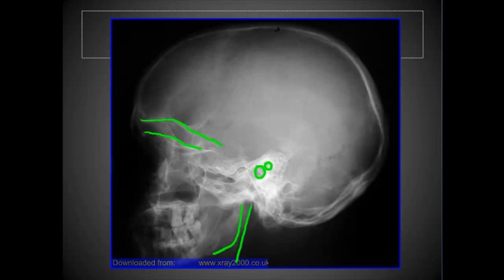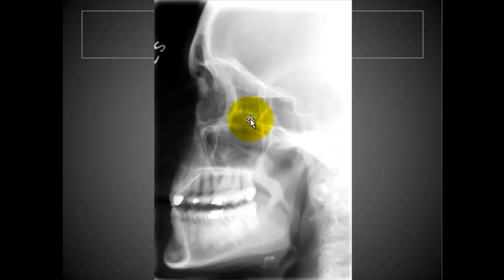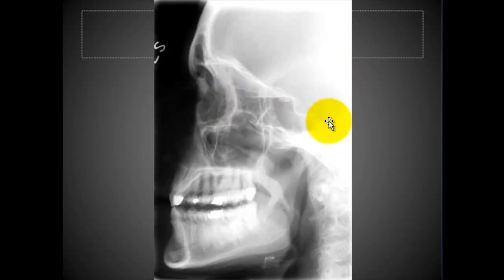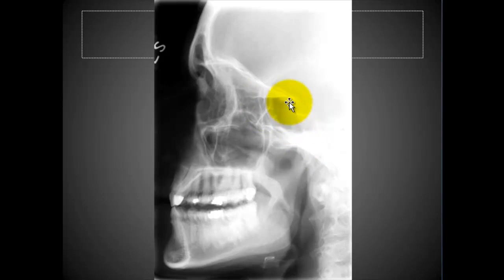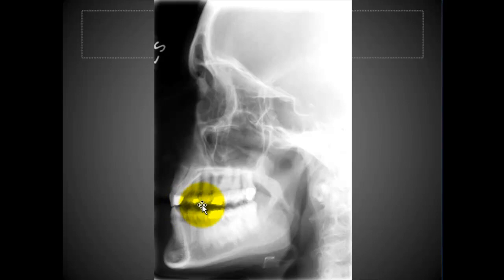Now when centering for sinuses, the central ray should be halfway between the outer canthus and the EAM instead of 2 inches above the EAM. This is a nice view of the sinuses — I definitely wouldn't repeat that. You've got sphenoid sinuses right here, right under the sella. Ethmoid sinuses up through here, maxillaries right here, and frontals there. You really don't need to include much below the top row of teeth for collimation.